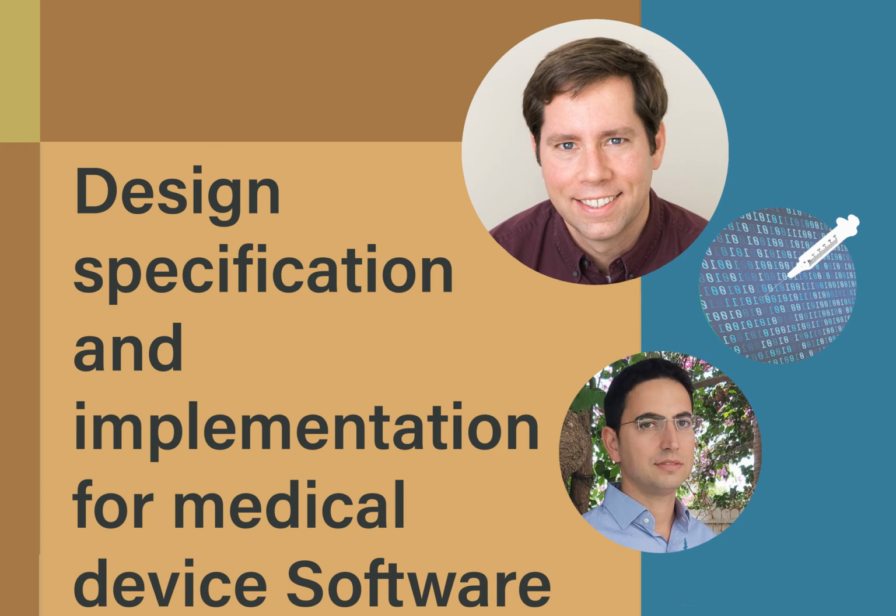If you're working on an MRI machine or a big surgical robot that has several different PCB boards, each running their own processor, at that point, I think it's probably useful to have a bit of a hierarchy in your design documentation. And I would say the high level is, these are the different boards, these are their areas of responsibility, and this is how they communicate. And then a detailed design would be, within each board, how is the software on that board designed to fulfill that board's responsibilities. So it depends on the complexity of your instrument.